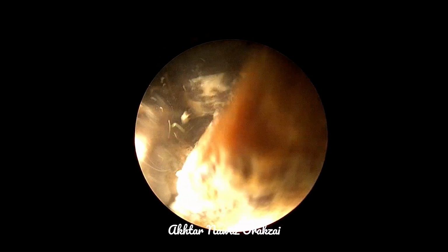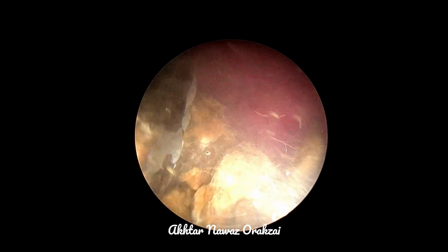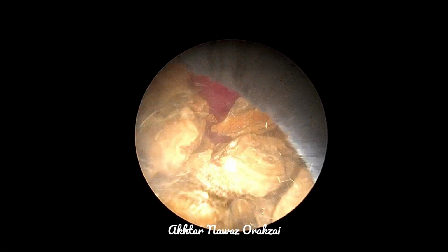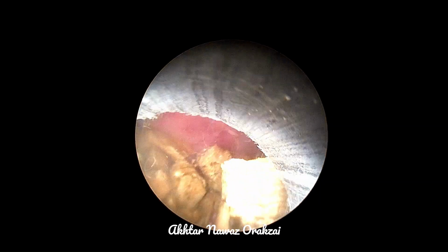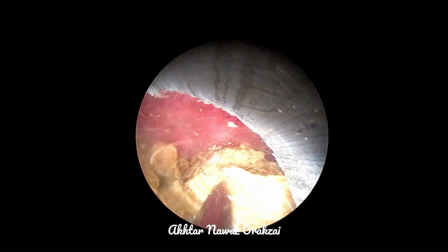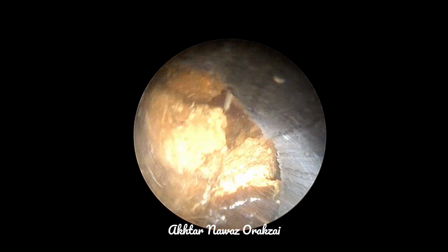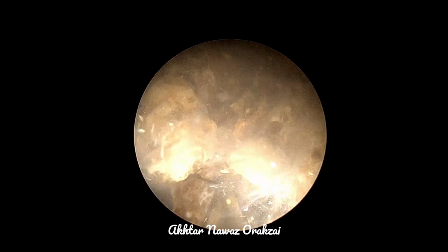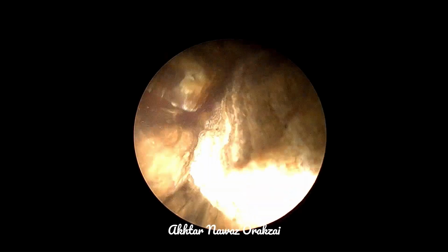So we will use pressure wash from the suprapubic tract as well as from the perurethral tract through a perurethral catheter, so that the fragments can be retrieved suprapubically.